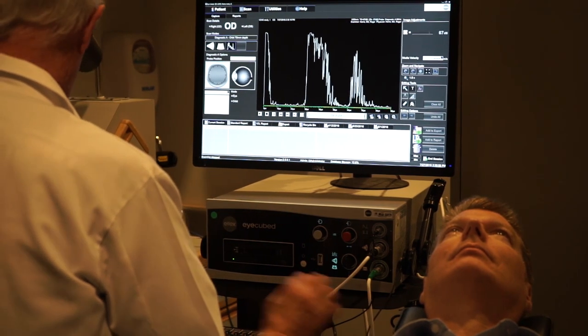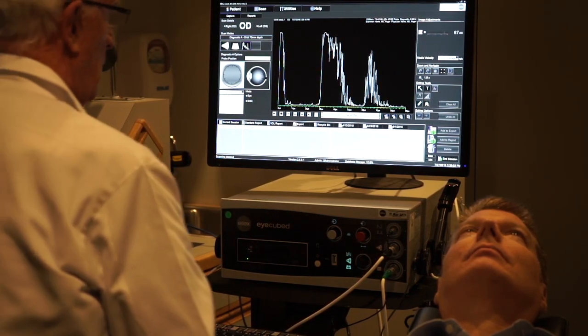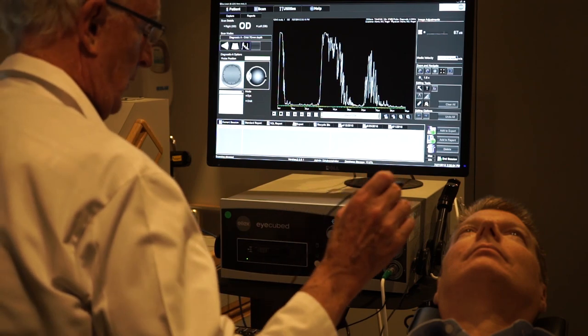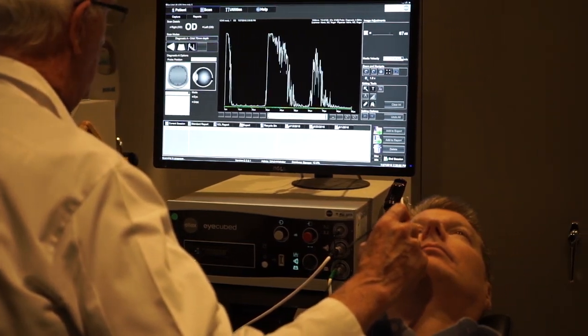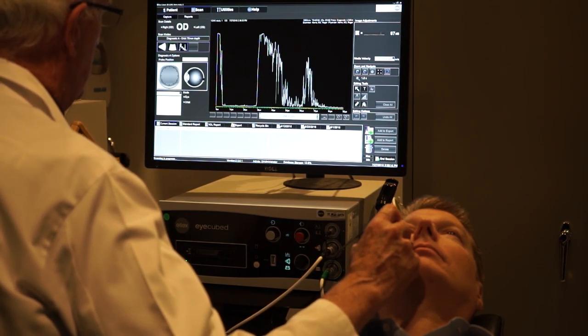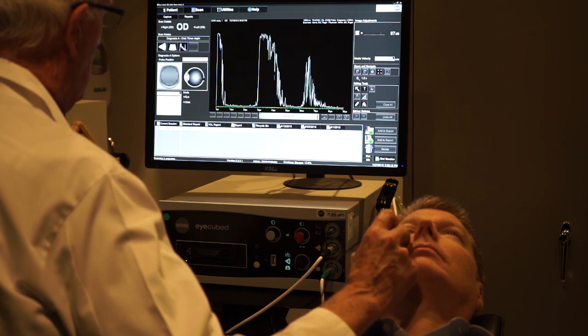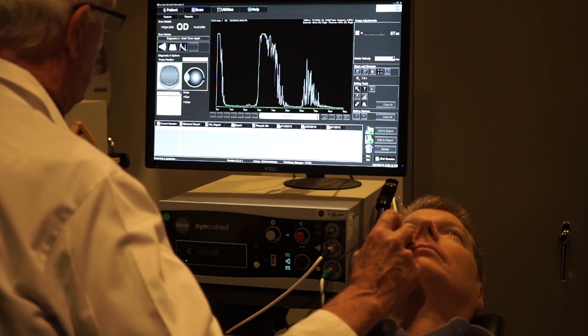A major advantage of the A-Scan probe is examining the orbit. We can actually quantitate muscles and nerves. If I aim towards the superior rectus muscle, I can actually capture the muscle right here.